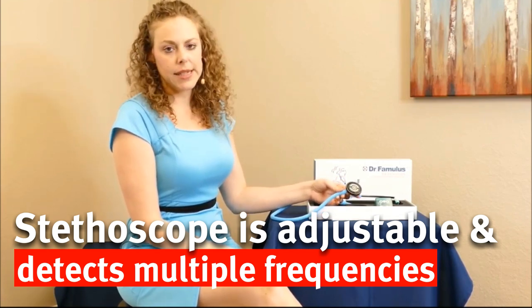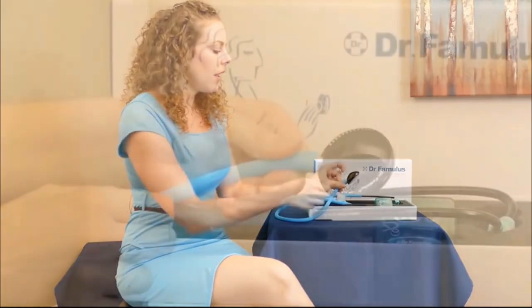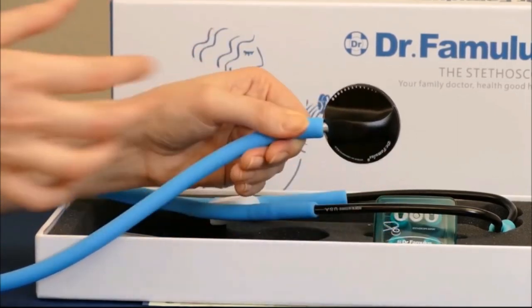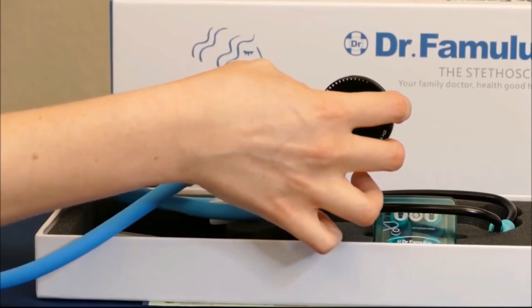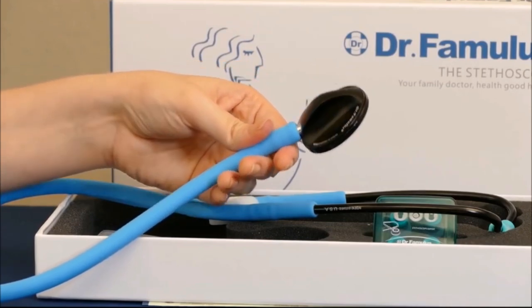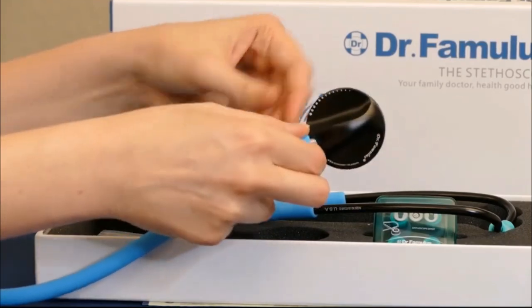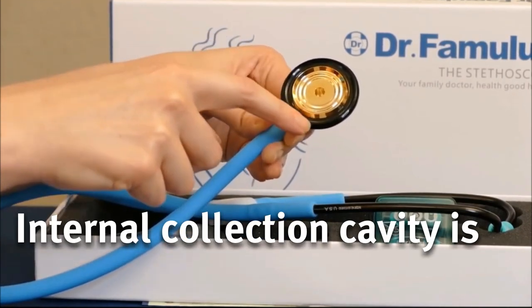It is still a multiple frequency adjustable stethoscope — simply by adjusting how much pressure you apply through the chest piece, you can move between low and high frequency sounds. The chest piece also has this little adjustable dial so that you can fine-tune for the different sounds you're listening for, making this a much more versatile stethoscope for louder sounds like breathing or the heartbeat, as well as other frequencies.